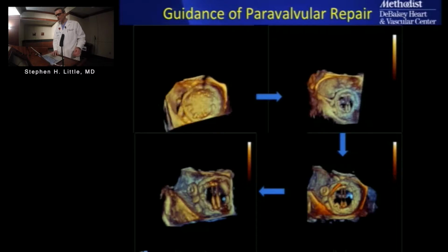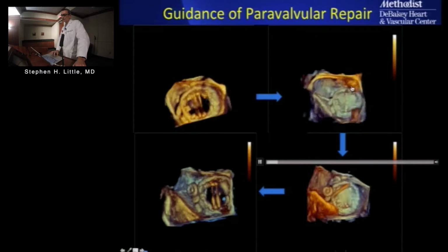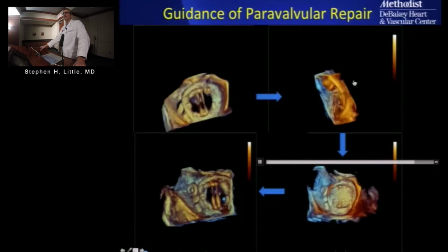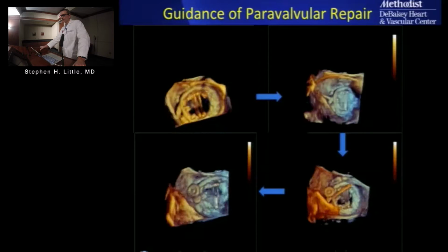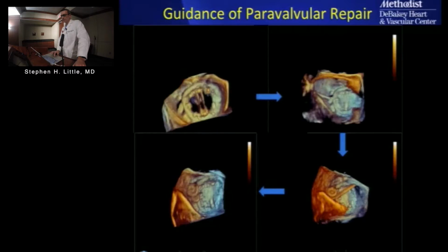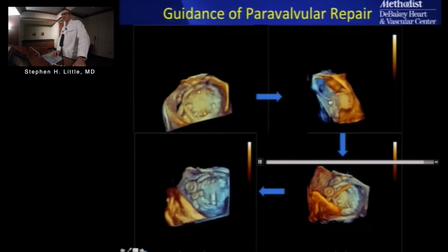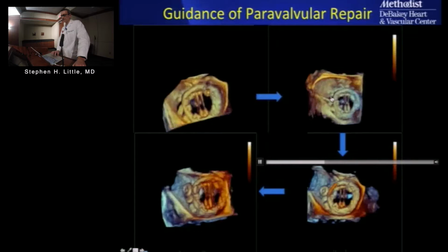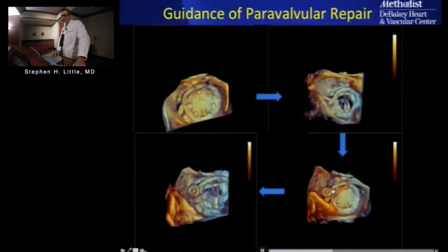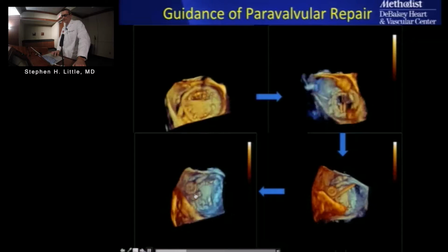This is an example, in one slide, of a procedure: paravalvular defect, a transeptal puncture. Again, we don't use this little rotation feature very often. In this particular case, it was interesting to show the length of the catheter, which is looping within a very large left atrial appendage and then diving across a transeptal defect. Sorry, not transeptal, across a paravalvular defect. Come down here, we see one device deployed, a catheter, and then finally 2 devices deployed, shown here.